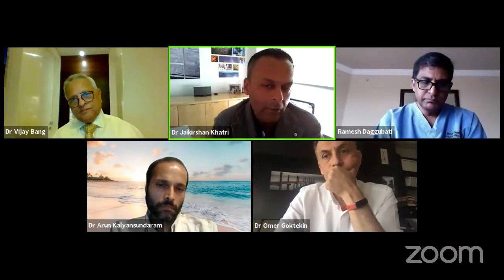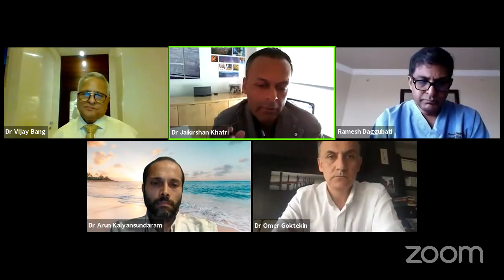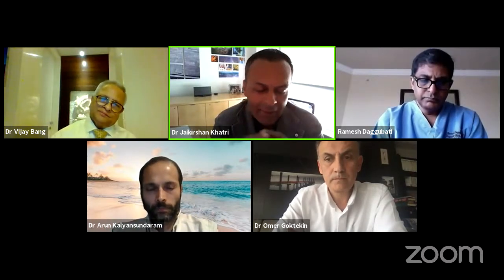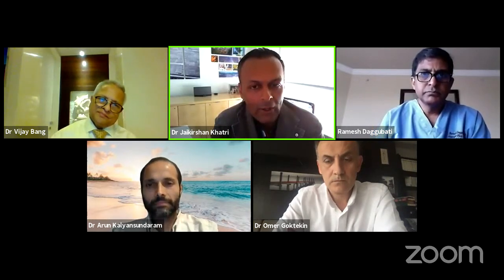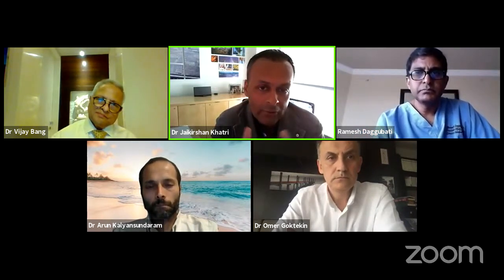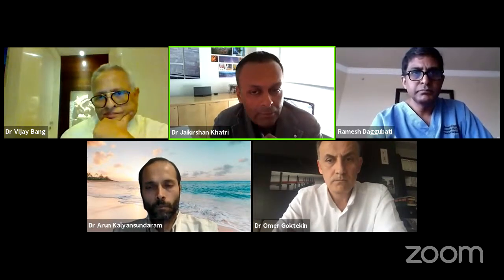Rather than being quick and aggressive to try to be efficient, if you just pause and take a look at some of these cues, and I tried to point that out in the talk, there's some things that the wire is telling you. It sounds a little hokey, but if you listen and observe what the wire is doing, you can often make a very complicated case a very straightforward case. And if you can keep it antegrade, we know that we can reduce complication rates, which is ultimately what this is about. Not only success, but to do it with low complication.